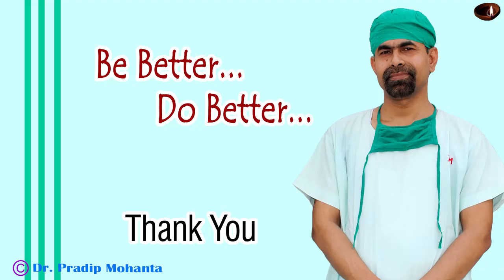A drop of moxifloxacin and one drop of SPMC is applied over the cornea and the case is concluded. Thank you very much for your attention. Hope this video will help you in honing your surgical skills. Be a great surgeon and serve your patients with love, respect, empathy, and great surgical competence.